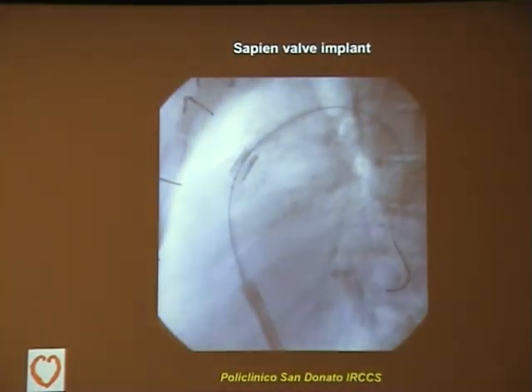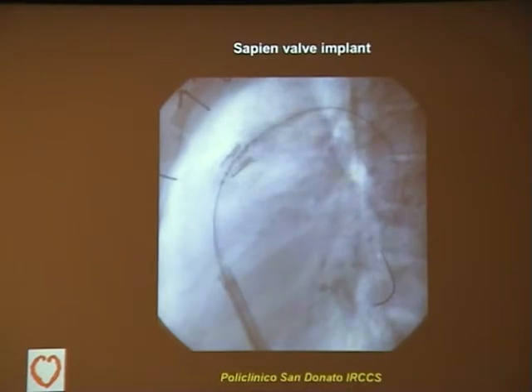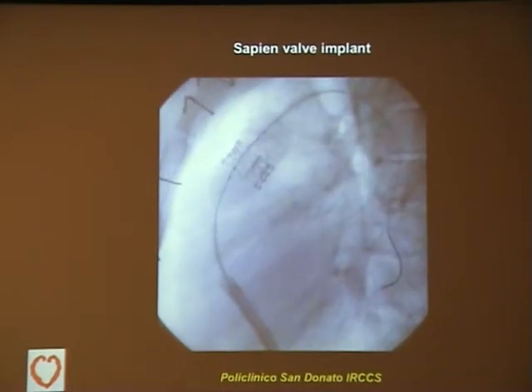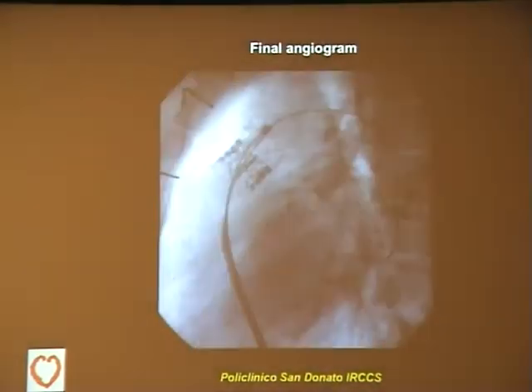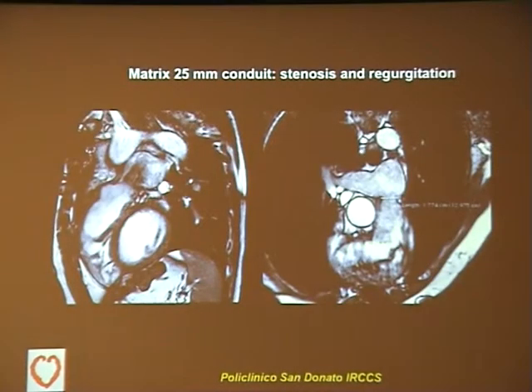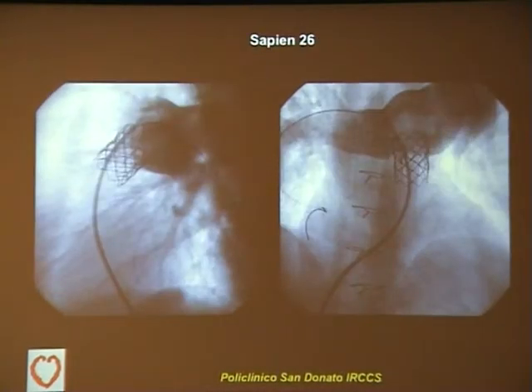And this is the Sapien valve implantation. The balloon is slowly inflated, expanding the stent, as you see here. The Sapien valve is the same as implanted in the aortic position, but of course in the pulmonary position it is mounted on the balloon in a reverse fashion. And that's the final angiogram. You see the perfectly restored pulmonary competence. Another example of a 25 dysfunctioning Matrix conduit with both stenosis and regurgitation, as you see in this angiogram, and then the angiogram immediately after implantation of a 26 millimeter Sapien valve.